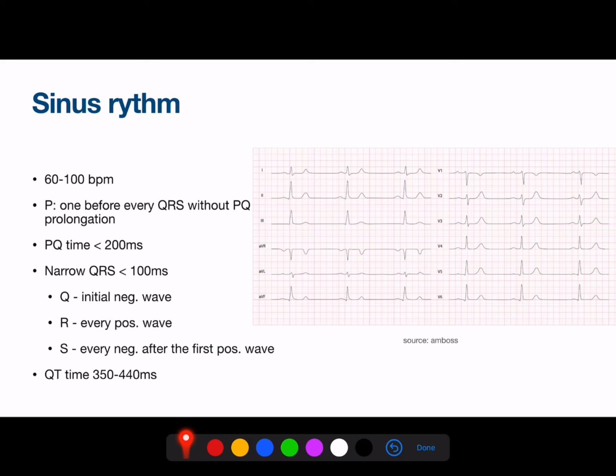But for now, it's not that important. The QT time from Q to T is around 350 to 440 milliseconds.